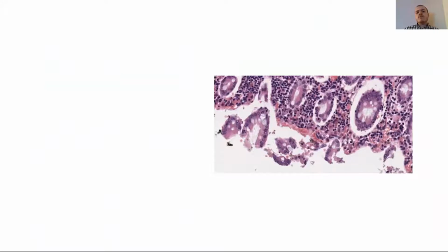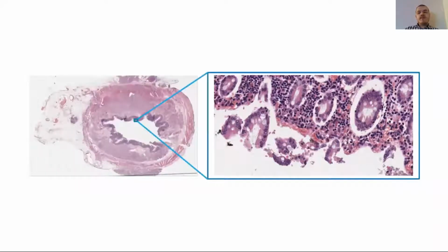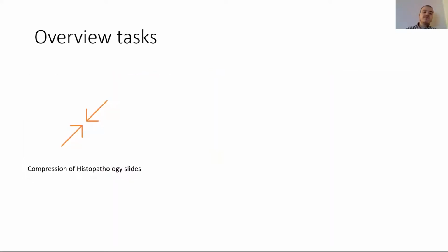So what's the problem? With the example tissue sample, which I showed on the previous slide, the image shown is only a small part of the actual tissue sample on the microscope slide itself. So to get a perspective on the issue, this is where it fits into the actual whole sample. And this means that the storage cost and the sheer amount of information to view by a pathologist is extremely large. So our research aims to help clinicians by aiding and simplifying the information load that they encounter while reducing NHS storage costs. So what am I doing for the PhD tasks?